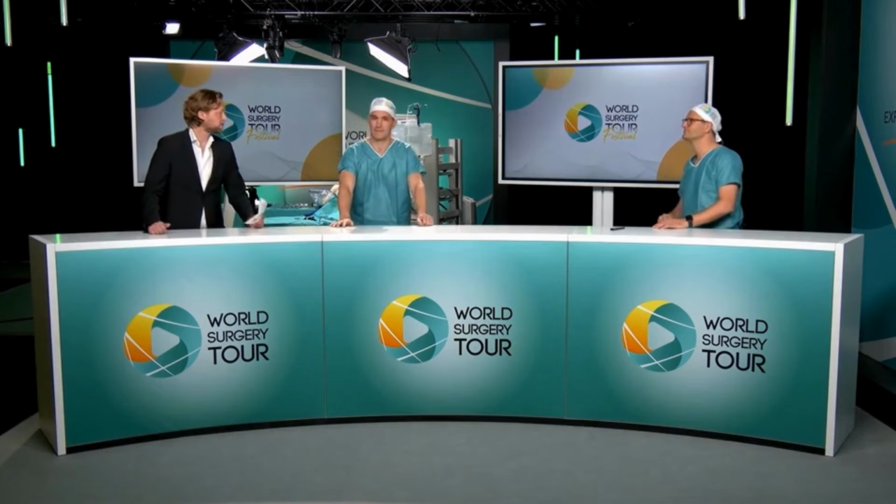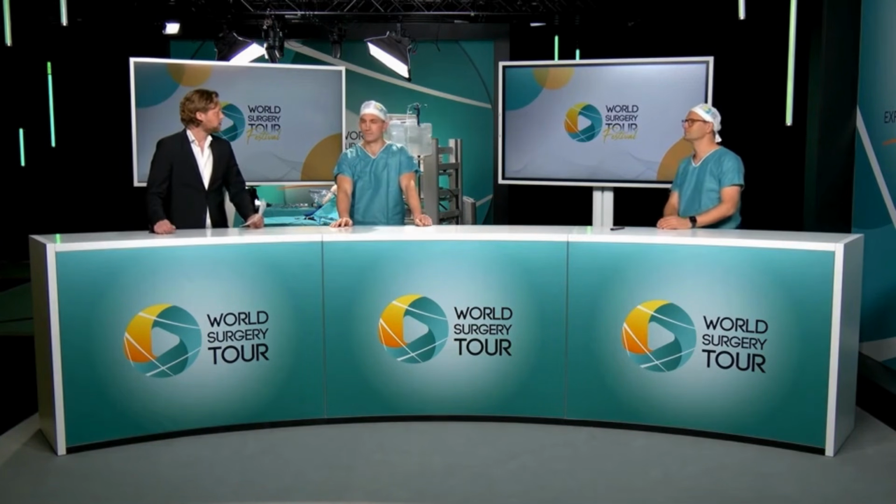Well, thank you so much. And I totally agree with you that you should drill your tunnels first and then drill the tunnel for the meniscus root tear. But one potential pitfall is that you can lose a lot of water by doing this. Is it a problem or don't you think so?